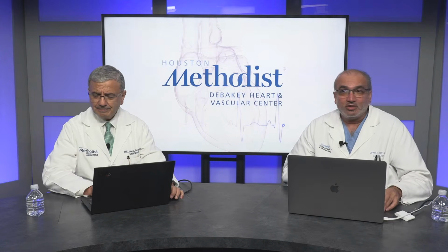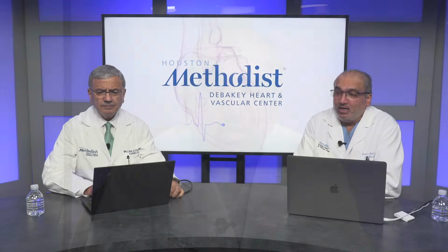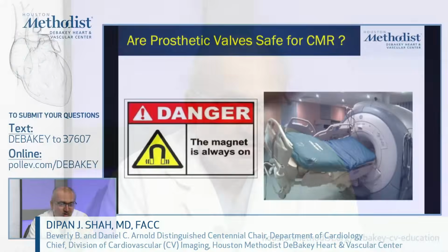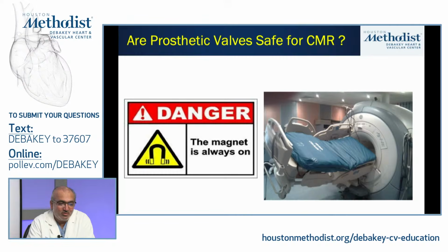Okay, thank you, Dr. Zoghbi. And let me go to my slides here, and we'll just touch on the role of CMR for prosthetic valves. I think the first thing, a question I probably get once a month, is: are prosthetic valves safe to undergo MRI? Because obviously we want to be careful with any metallic objects because of the potential risks with MRI.